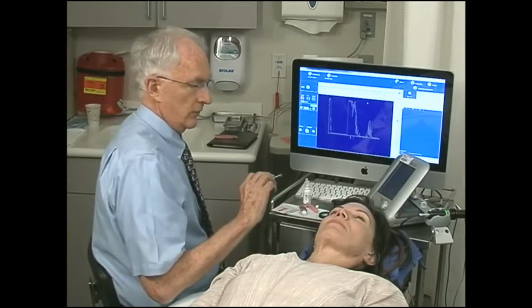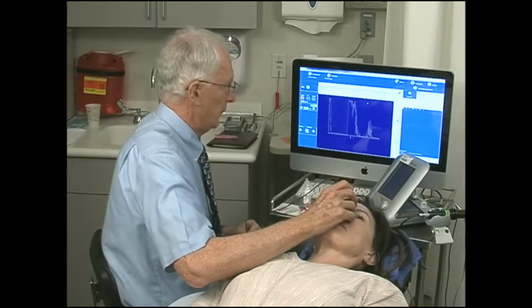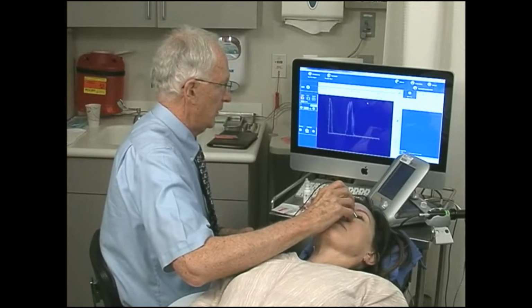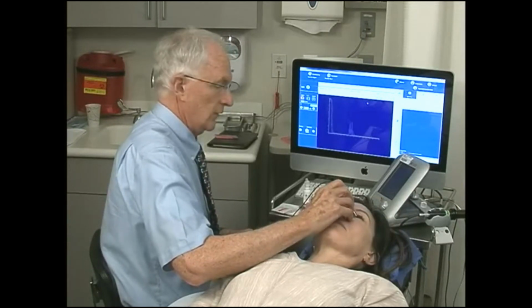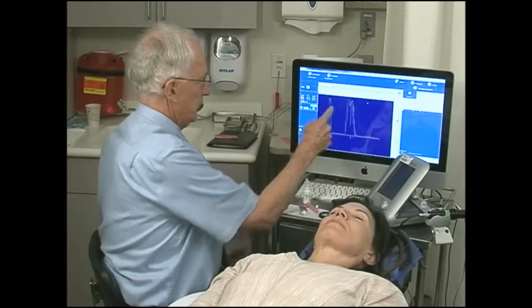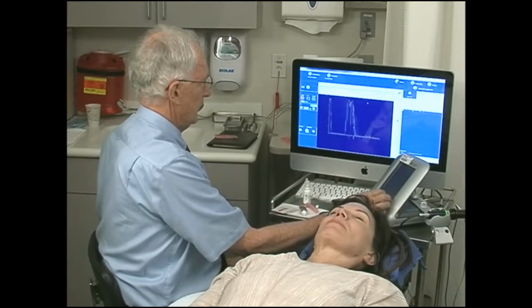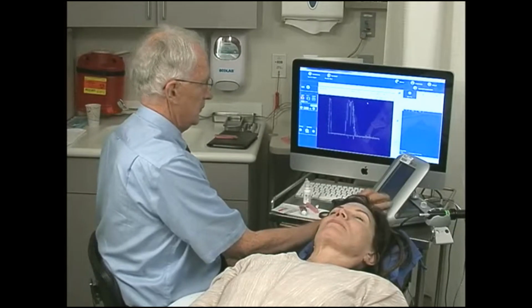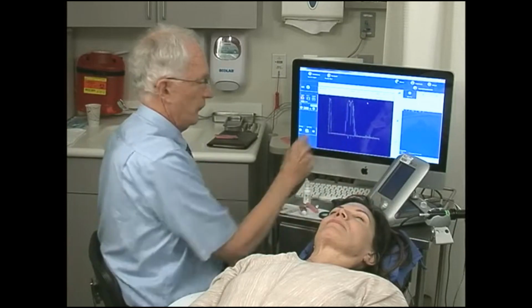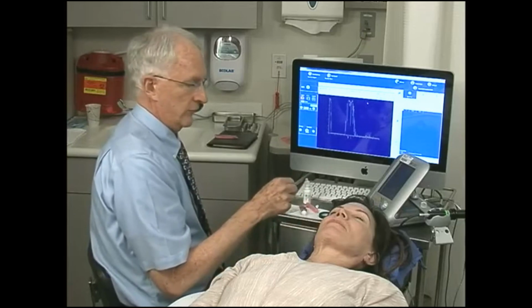We then measure the lateral rectus muscle by placing the probe nasally on the globe. And again, we aim towards the lateral rectus muscle across the globe. We watch the orbital pattern for a dip in reflectivity and use that for our measuring purposes. So there to there would be the muscle sheath. We place the cursor on one side of it, then the other side, and measure the muscle thickness of 3.37 millimeters. So I measure the 4 rectus muscles.